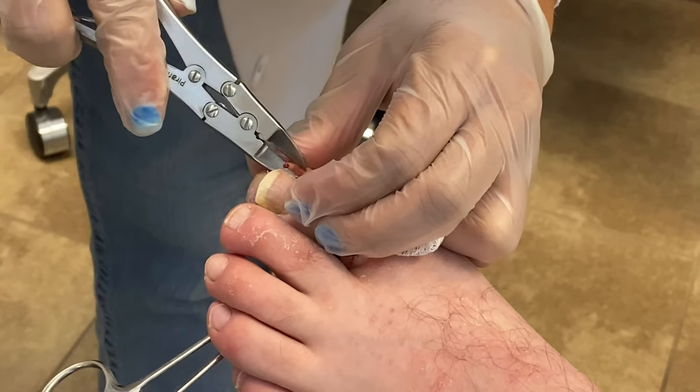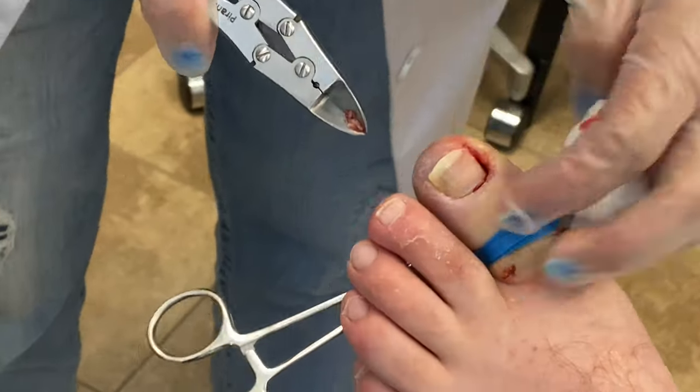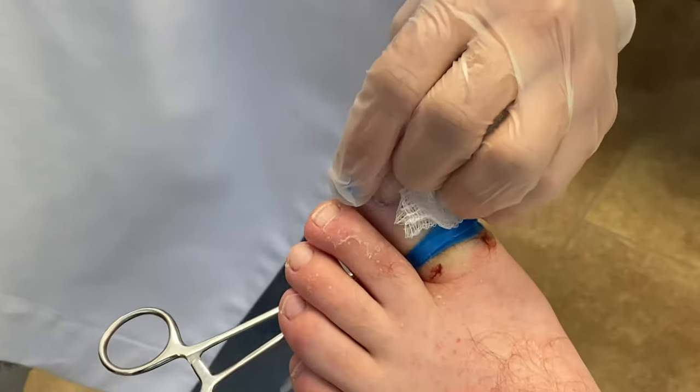Then we have to clean up the tissue along the nail border. This is inflammatory tissue that develops because of all the inflammation that happens with an ingrown toenail.